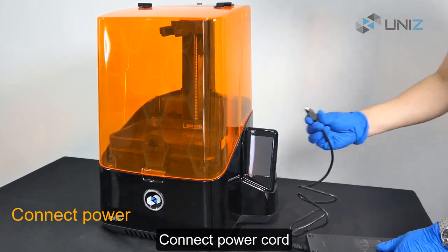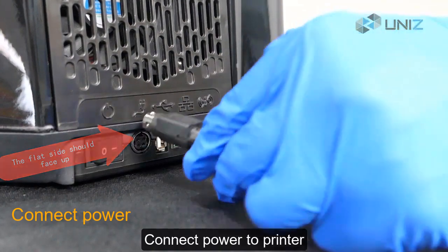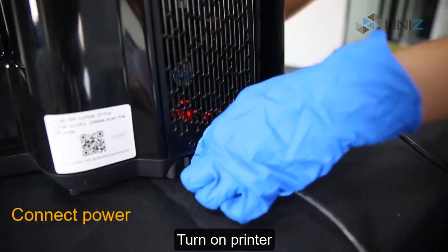Connect power cord. Connect power to printer. Turn on printer.